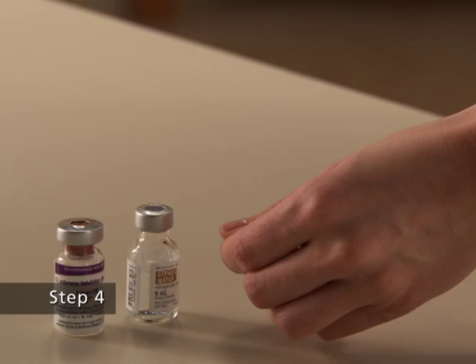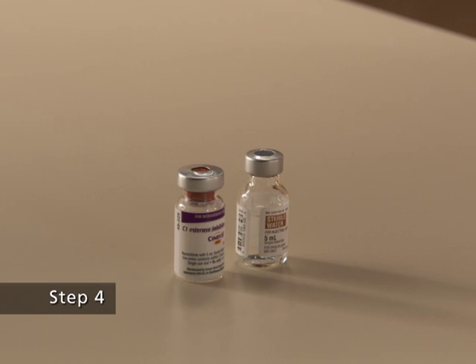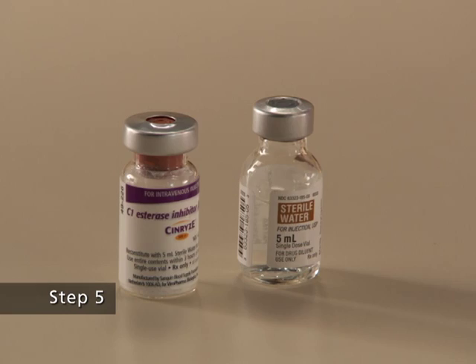Step 4. Wipe the top of the vial of Synrise with an alcohol swab and allow it to dry. Do not blow on the stopper to dry it faster. After cleaning, do not touch the rubber stopper with your hands or allow it to touch any surface.